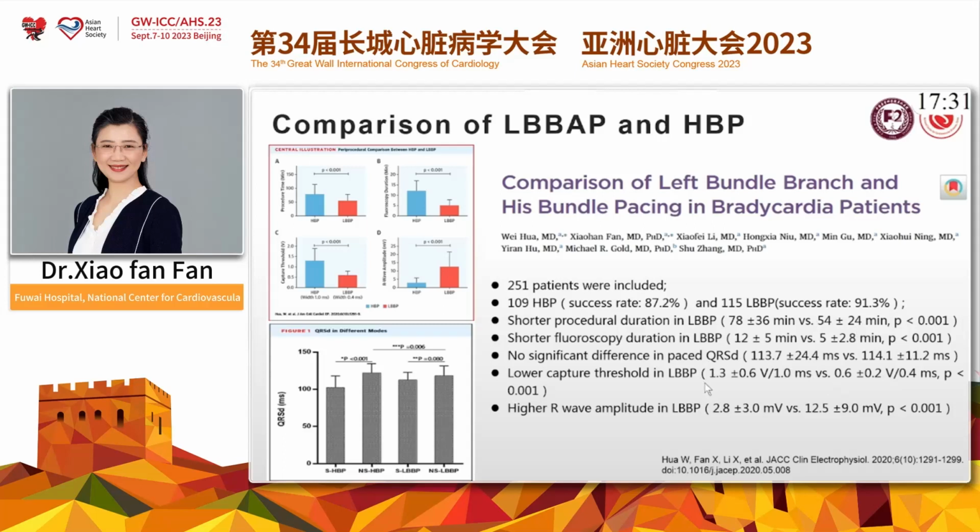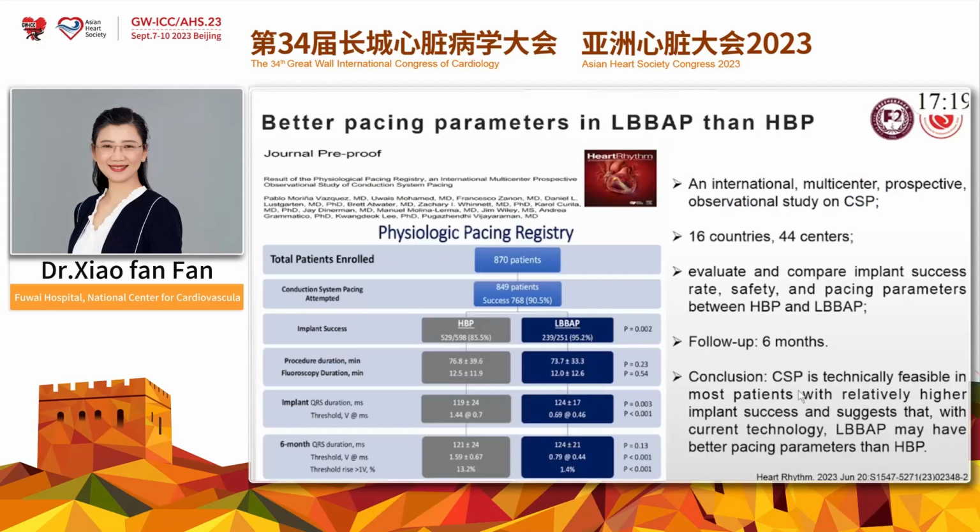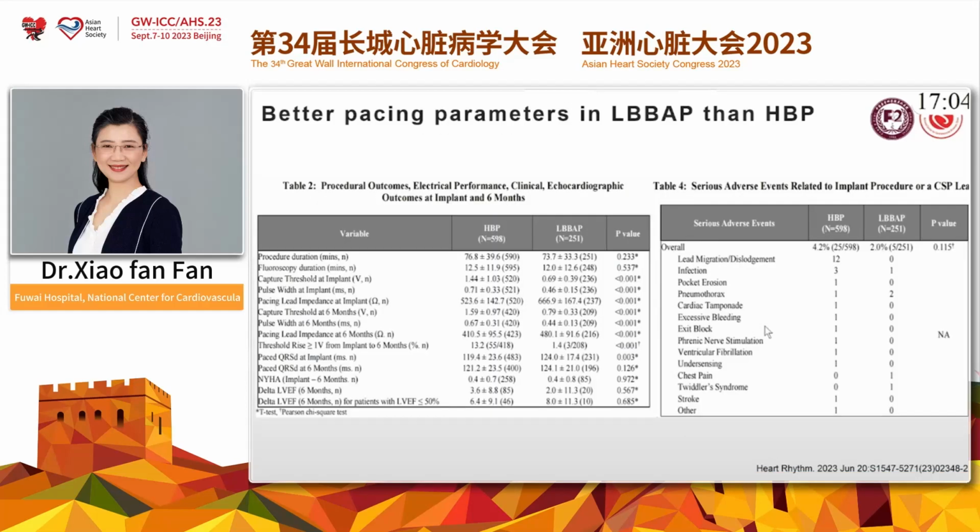We also found the pacing parameters of LBBP are better than those of HBP. This year, a study in the journal Heart Rhythm also compared the pacing parameters between LBBAP and HBP, and they found LBBAP has better pacing parameters than HBP.